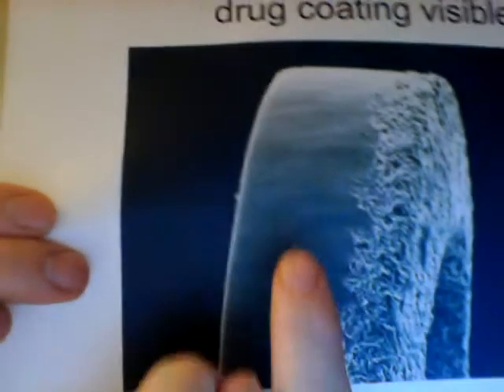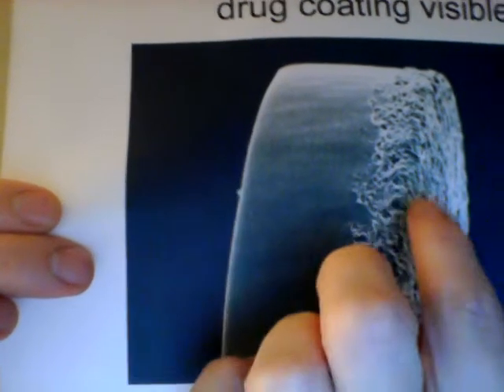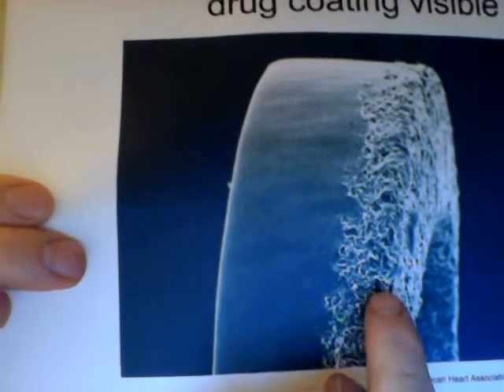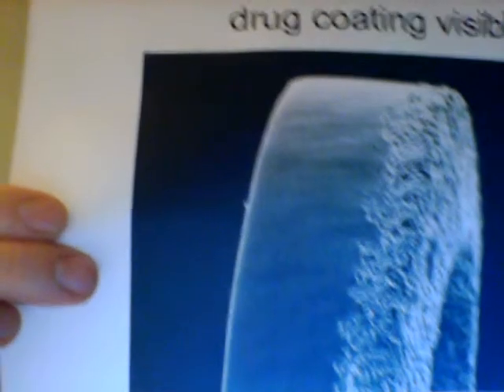The actual stent, and this is a great picture from the American Heart Association, gives you a microscopic view of what a drug-eluting stent looks like. This is the actual metal part of the stent itself, and then you see the microscopic drug that is placed onto the stent, and this is put on there with a polymer coating, which allows for the drug to elute into the system over a period of time.